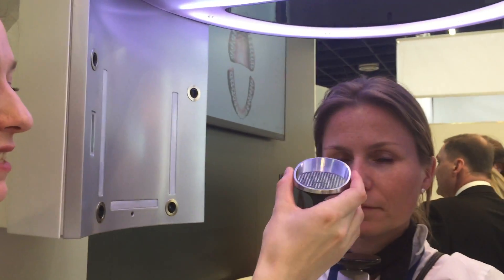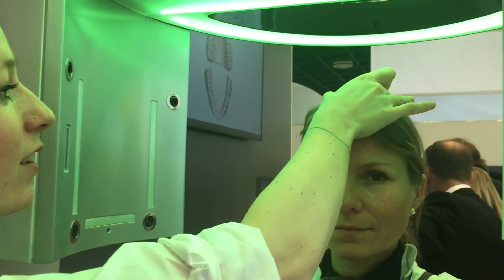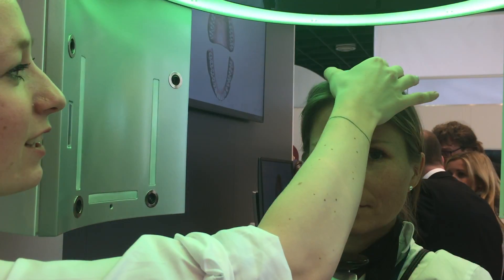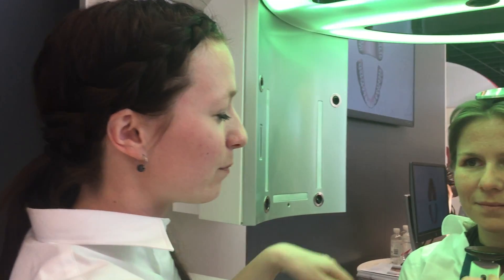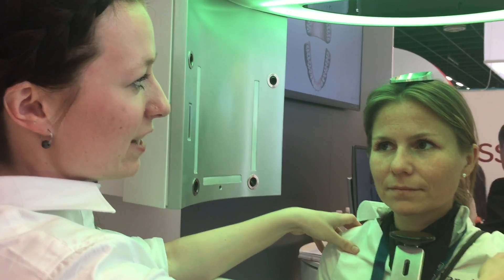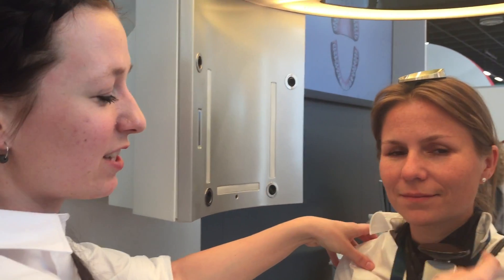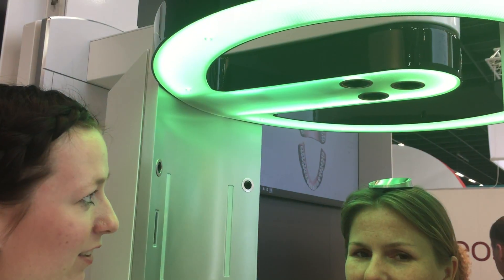I'm going to place this on the patient's head. And now we see a screen light, meaning that the position is correct. But whenever we move the patient outside, it gets orange, meaning that the position is not correct. So now we move her back.